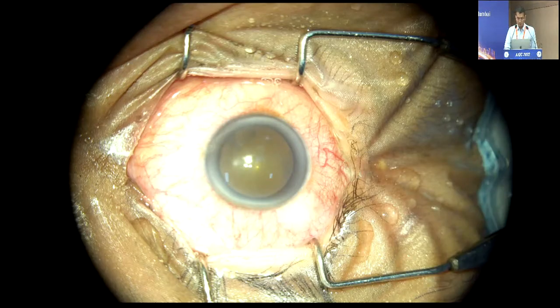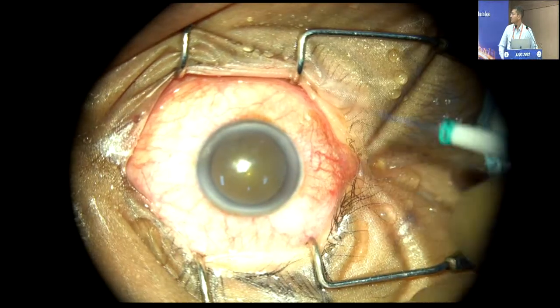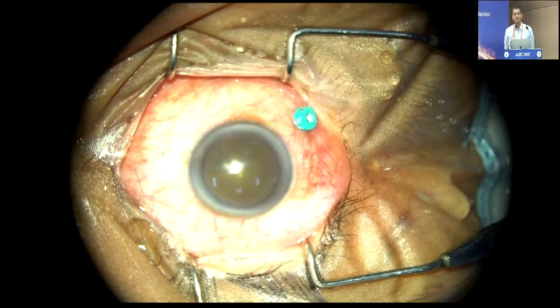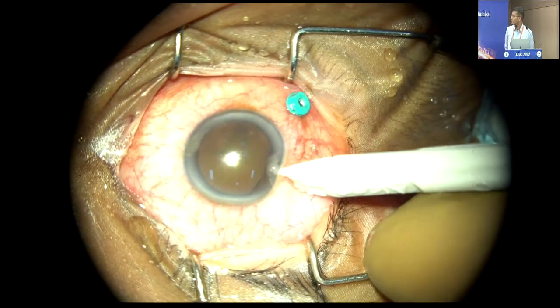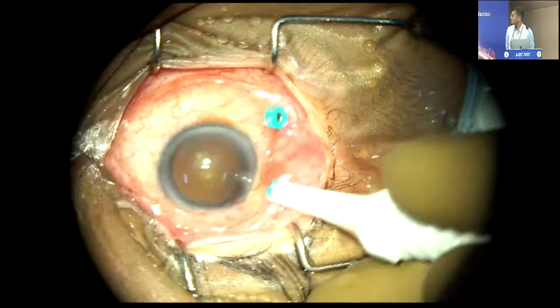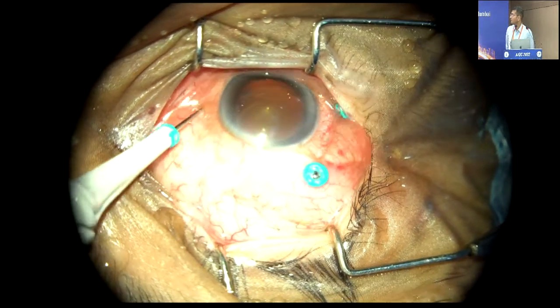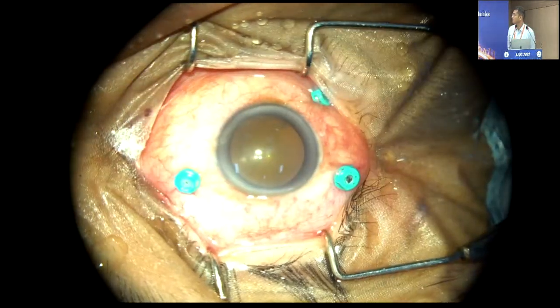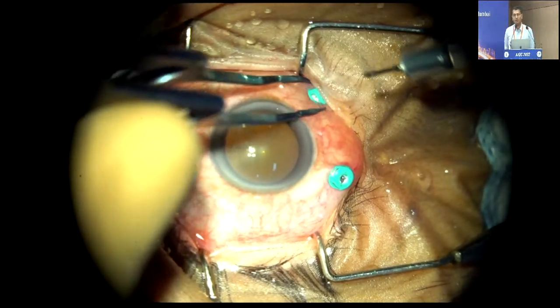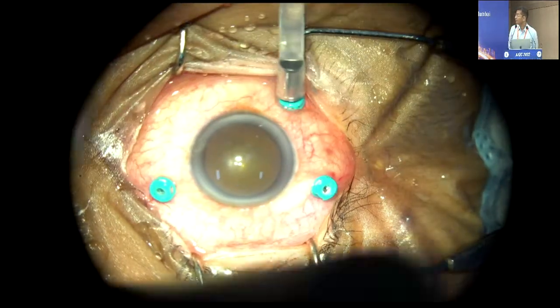The plan was to do 25-gauge MIVS with ILM peeling, endolaser, and sulfur hexafluoride tamponade. This is the first step — making entries into the vitreous cavity using valve trocar cannula 25-gauge. There is a small amount of cataract, but it was assessed pre-operatively that it would not hamper the surgery, so cataract surgery was not planned.